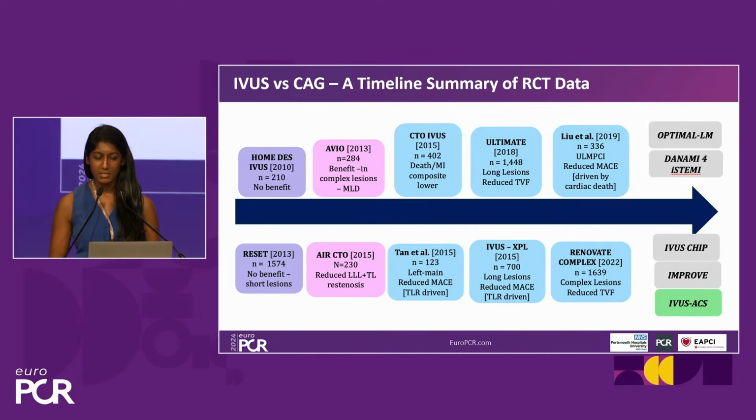of randomized data, the initial data for IVUS didn't really show a benefit of the use of intravascular ultrasound from HOME DES IVUS and RESET, but these were short lesions. We then had AVIO and AIR-CTO that looked at more complex lesions, and there was some benefit in the soft endpoints of minimal lumen diameter and late lumen loss, but no benefit in hard endpoints.